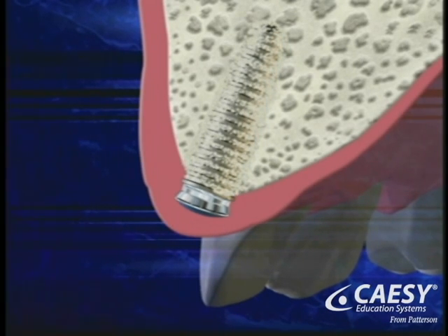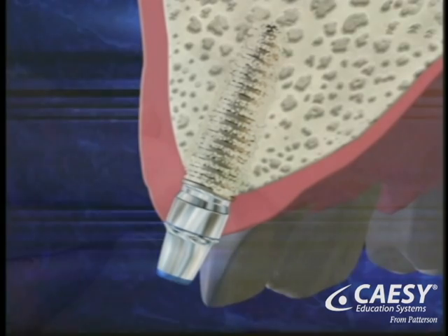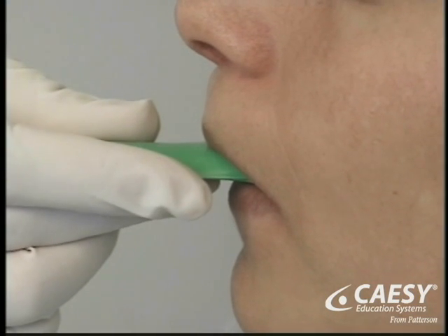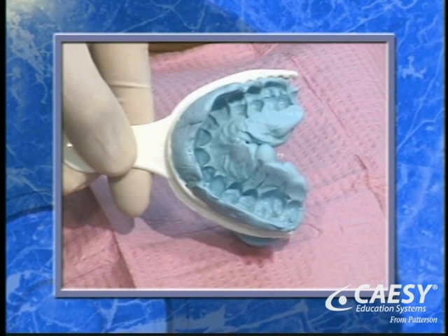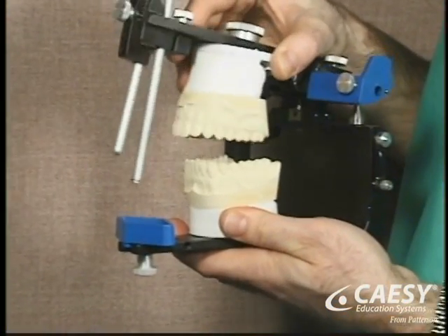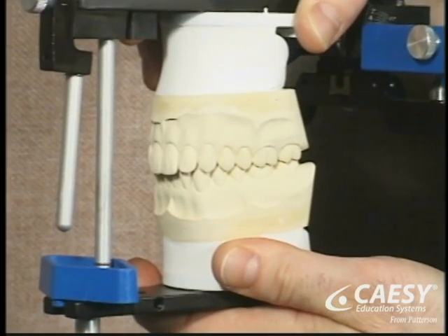The second phase starts with surgical exposure of the implant. Another incision is made in your gums and a small extension is placed to bring it above the gum line. We then start a series of appointments to make your new teeth. Though some of the steps might be different in your case, they usually include making impressions of your mouth. From these impressions, we make precise working models of your mouth which are carefully mounted for proper alignment.